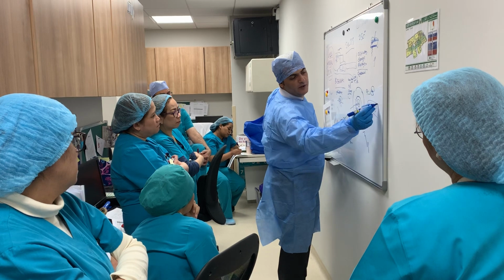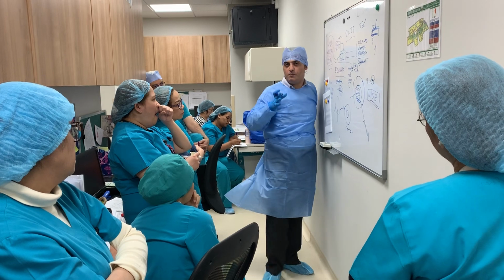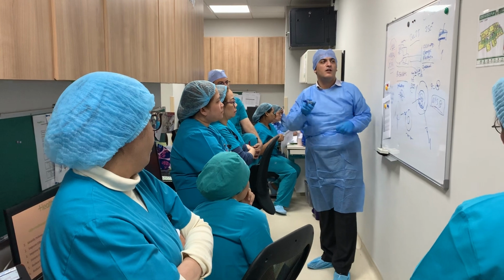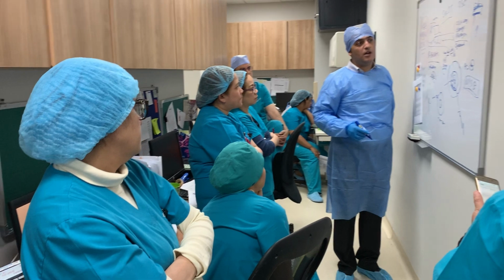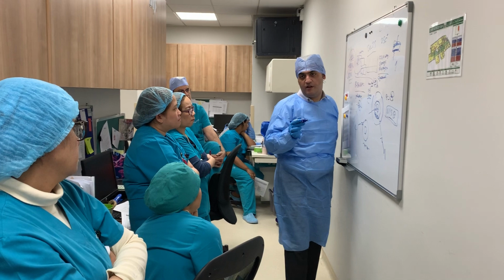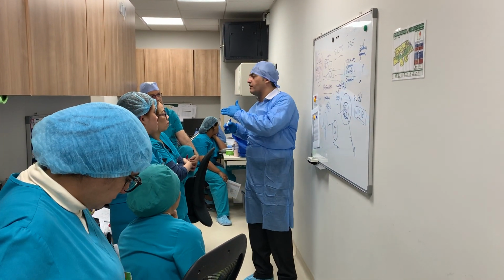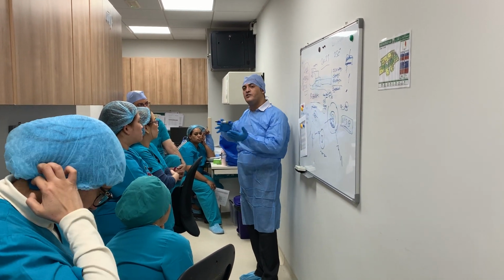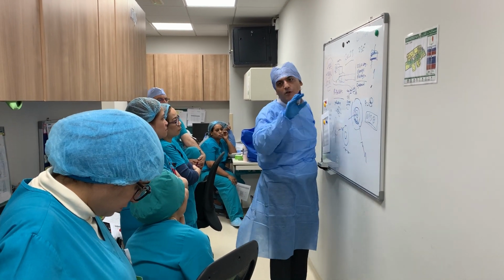This applies to everything, even gender selection. If someone is using particles for gender selection, you keep to the dose, the concentration that you're using against the concentration that you need. The concentration has to be sharp, but it's never sharp, because the concentration of sperm is never accurate. You would say I see 5 million, but it's actually 6 million underneath in another layer. So you just make an estimate. This is why we say in the range from 5 to 10 million. It's never accurate, but there is a good estimate.